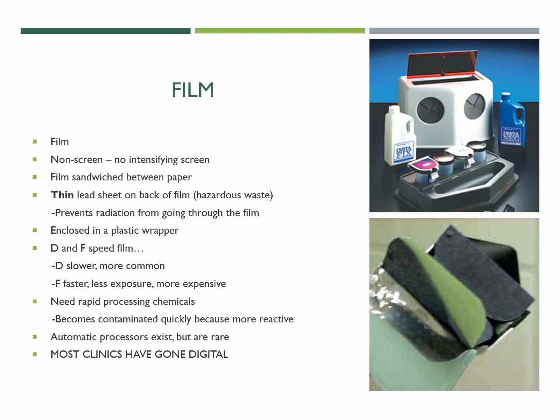Now, I've worked in places where we did film, and I filled up little urine sample cups with our fixative, our developer, and all the chemicals in there, and you would just dip tank. There were little automatic processing machines.